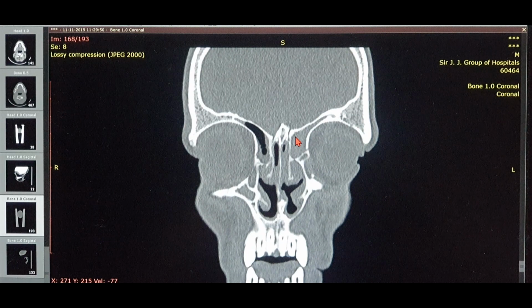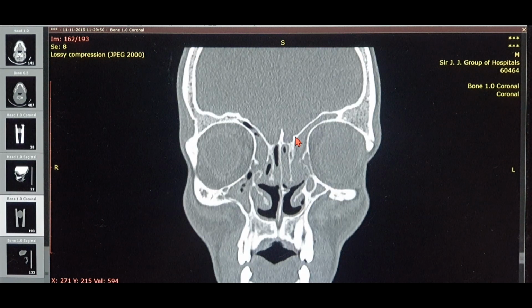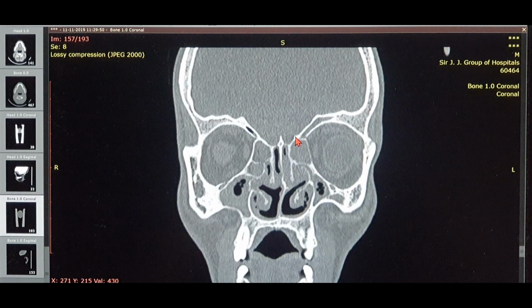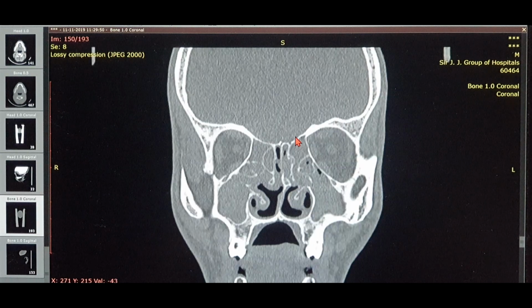So basically the examiner has got 4 spotters for you, one of them being the specimens, surgical instruments, CT scans, MRI scans. It can be of any region: the CT head, CT brain, CT orbit, CT PNS, MRI neck, HRCT temporal bone. So they just might ask you any simple question about the anatomy as a spotter. So I've been there, I've done that. This is all I'm talking about, whatever experience I have in my teaching career. So I hope to share this with you guys.